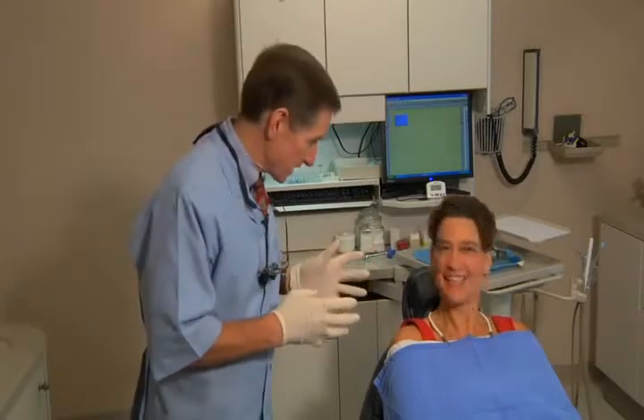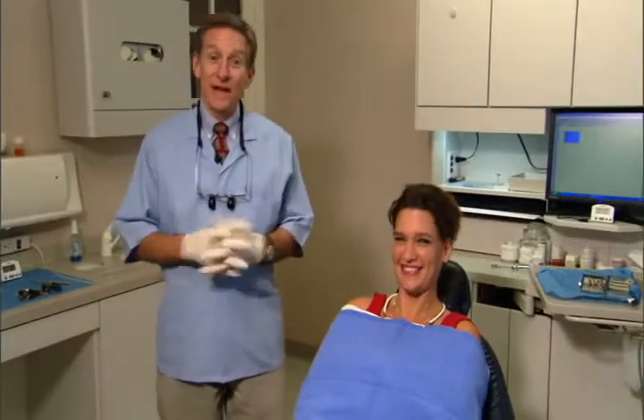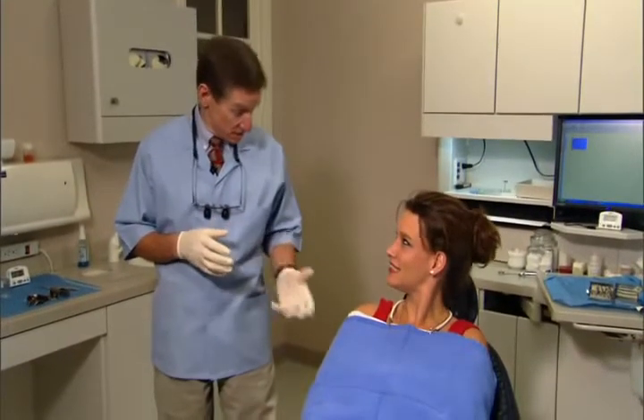Our patient today is Denise Radcliffe. Denise is recently married — last Friday — so she hasn't gotten a lot of sleep, but she's our treatment coordinator and has volunteered to be in this video. Let's go through the eight steps.